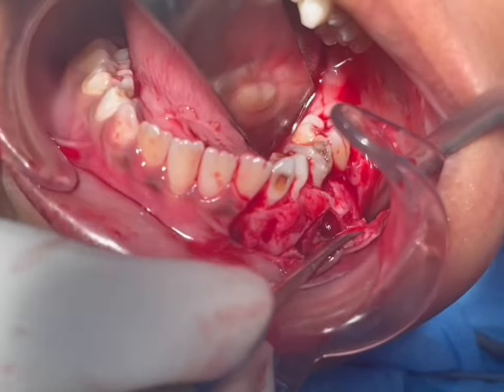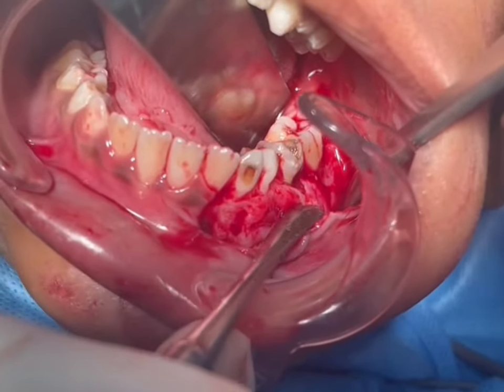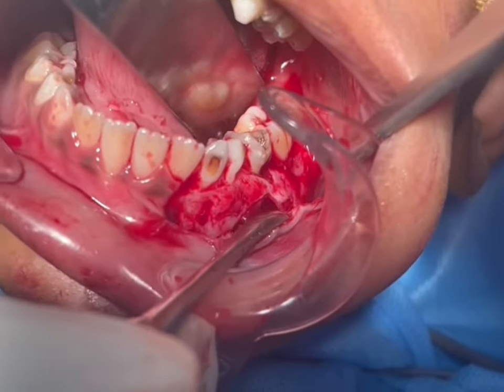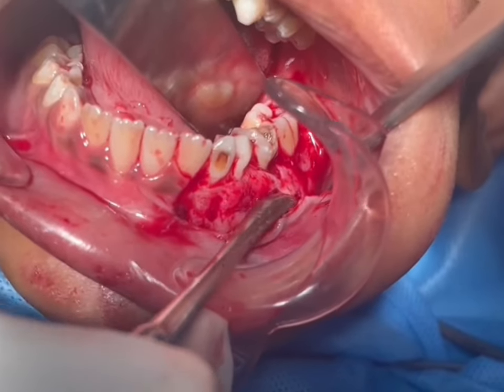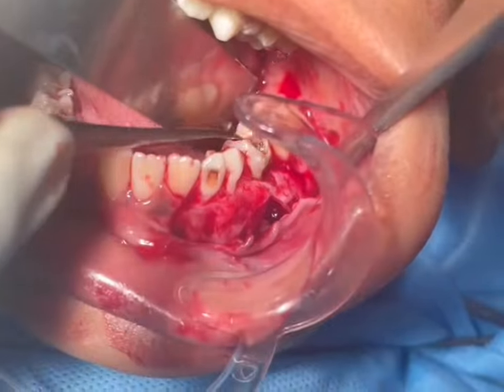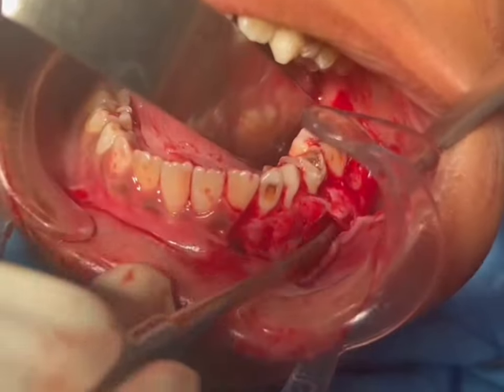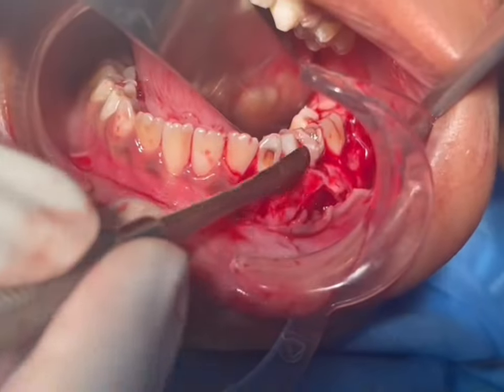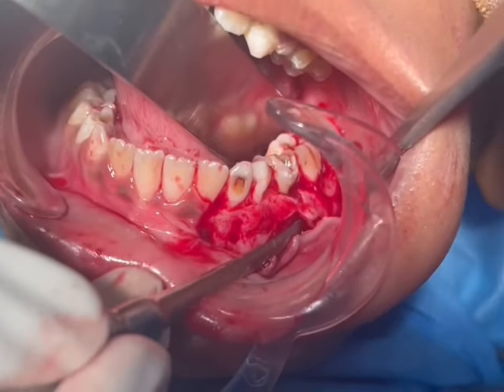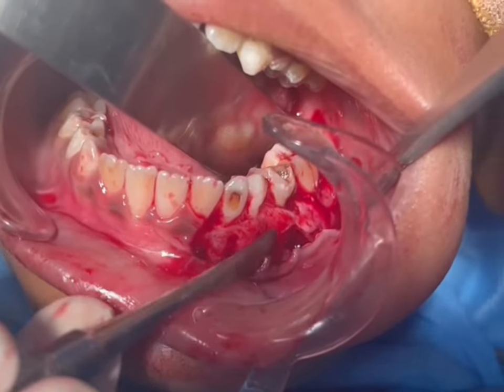What we are seeing here is the cyst which is eroding the labial or buccal surface of the cortical plate. These teeth are mostly decayed and the cyst is originating from these teeth. There is also one impacted tooth, which we'll show you later on the radiograph.